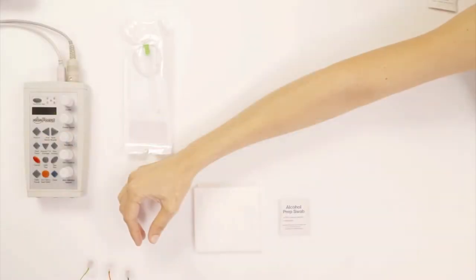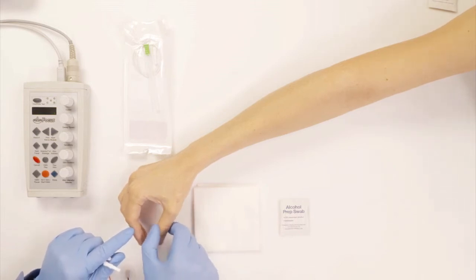Let's get started with the needle exam. The first muscle that we're going to do is the first dorsal interosseous, which is right here between the index and thumb. And this muscle is innervated by the ulnar nerve.